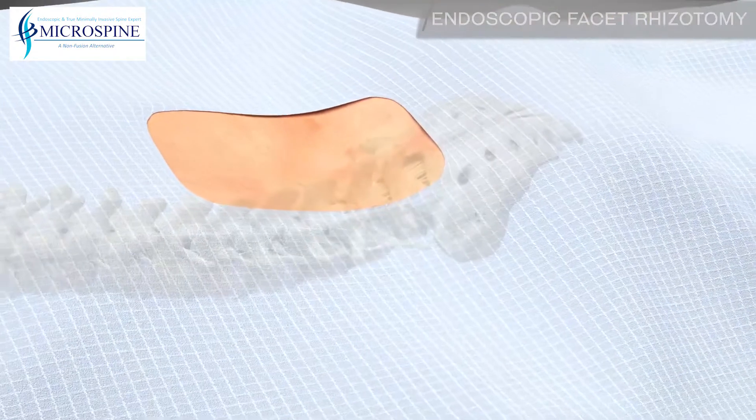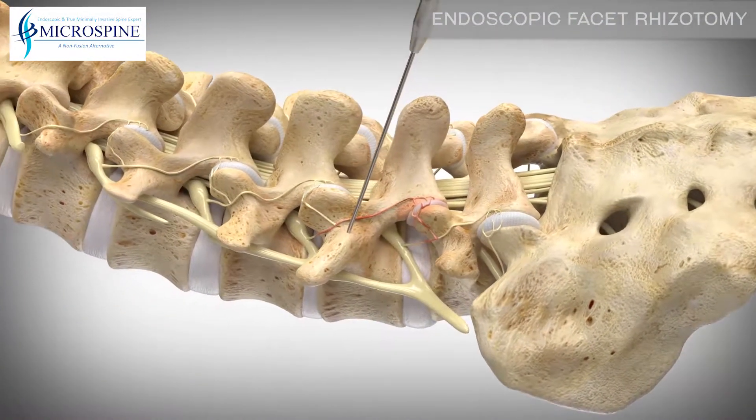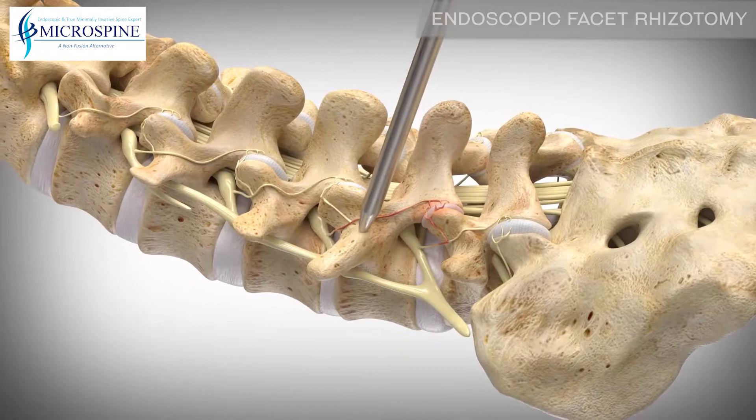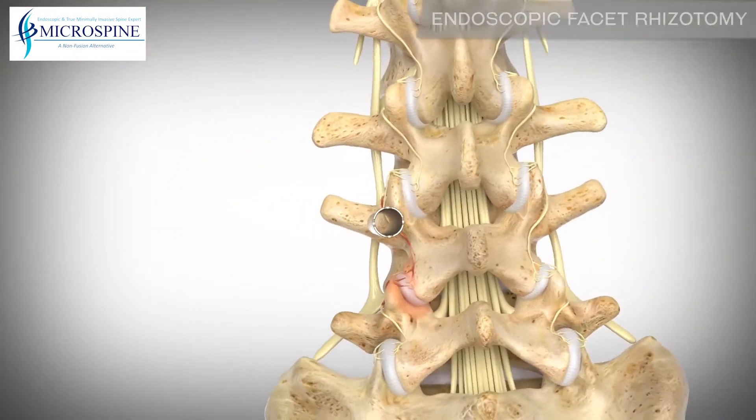The surgical site is located by placing a small guide wire near the facet joint. A dilator, smaller than a pencil, is placed over the guide wire. A tube is then placed over the dilator to create a portal down to the nerves.